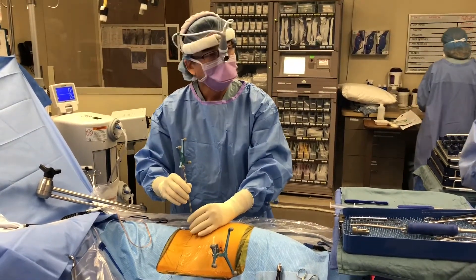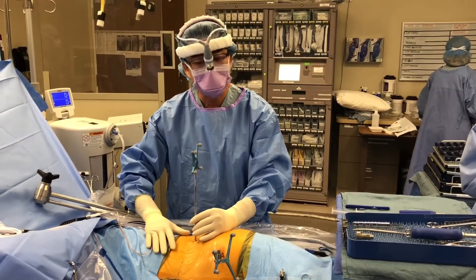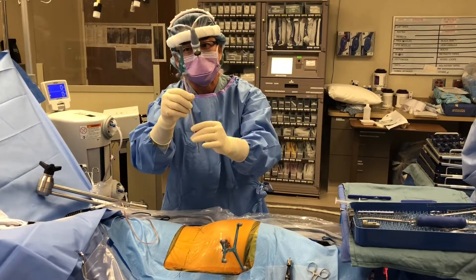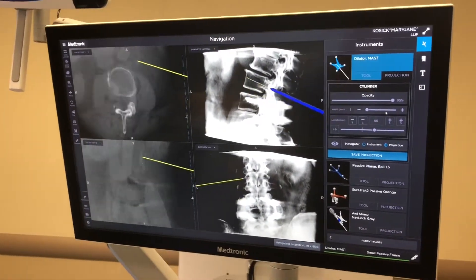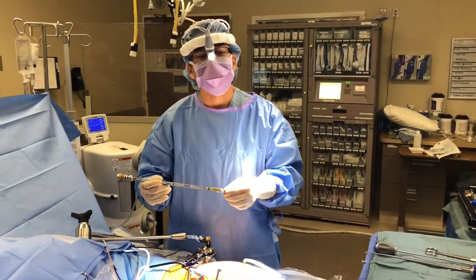We're about to get started. Everyone asked me about computer-assisted navigation — that's this system right here. We took a three-dimensional image of the spine, we have this navigation probe, the cameras are up there, and using this probe I can basically identify exactly where I want to start, even before I make the incision.